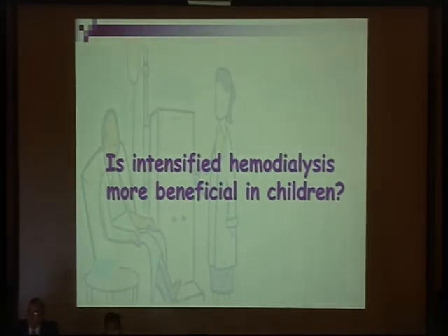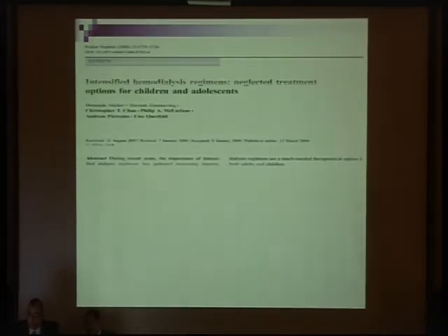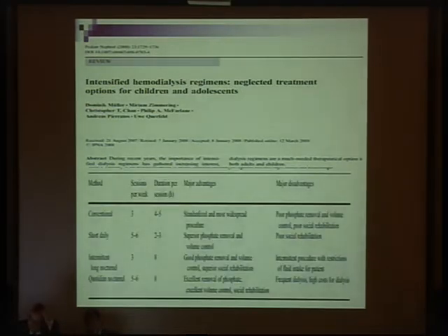So this is an important question: whether using intensified hemodialysis is more beneficial or not. Some centers are using a more extended duration of the session with more frequency, like 8 hours, more than 3 times per week. The literature here says that intensification may be more important in children, and it can give them the opportunity to catch up on growth like normal children and have a better quality of life. So here, hemodialysis in children is not just to keep them alive, but to give them some quality of life.